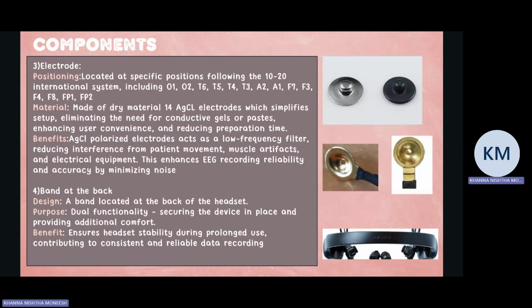The benefit of this is that silver chloride polarized electrodes also act as a low-frequency filter, reducing interference from patient movement, muscle artifacts, and electrical equipment, hence enhancing EEG recording.